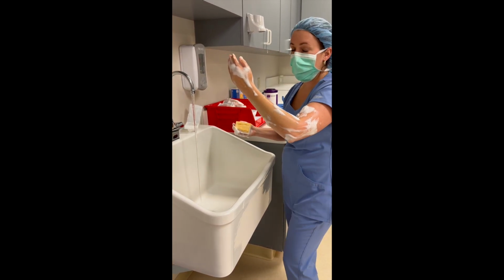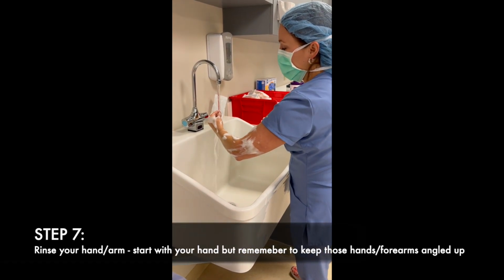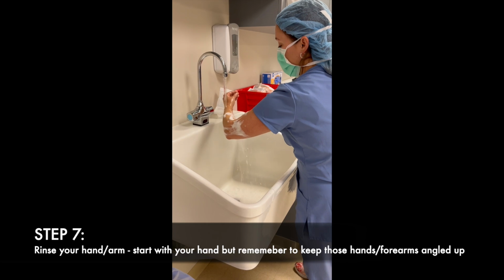So now I'm going to rinse this hand. Slow and steady wins the race. So you start with your fingertips together and you just rinse it slowly through. You don't want to go backwards because that's not the goal. We're not trying to re-send suds back the other way. We're going to send it straight through like this.